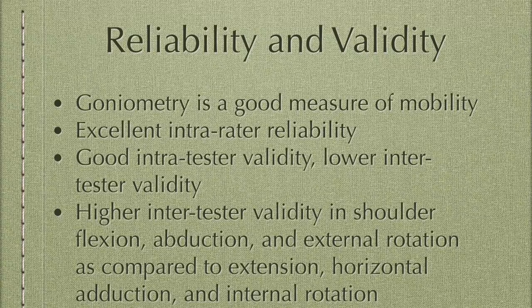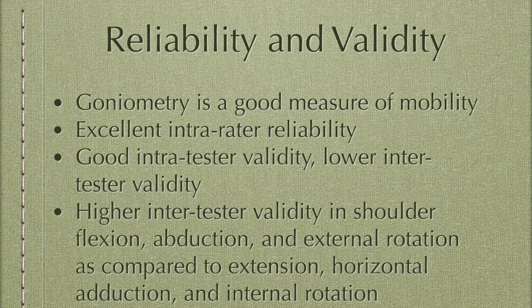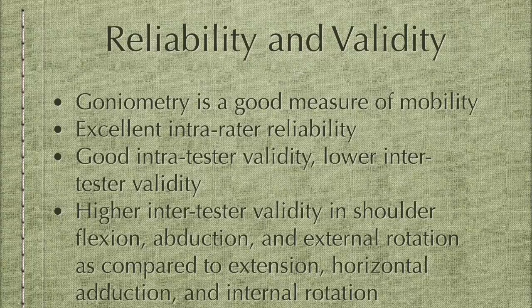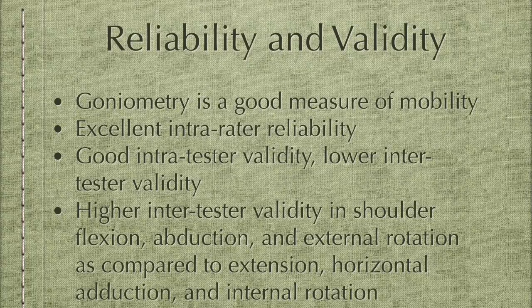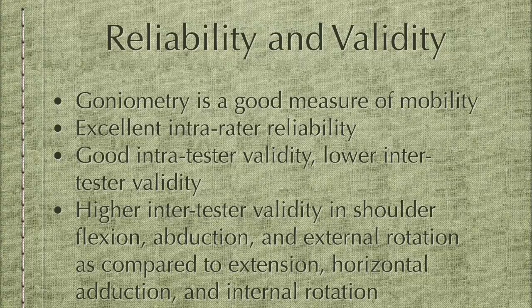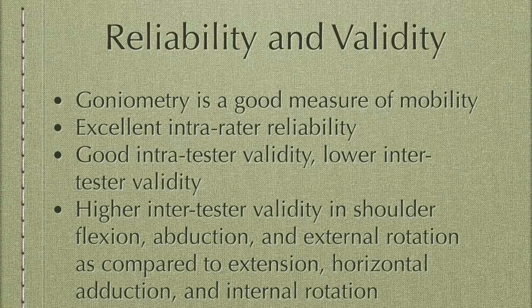However, flexion, abduction, and external rotation have a fairly good inter-tester reliability, especially compared to measurements of extension, horizontal adduction, and internal rotation. This is because it is more difficult to standardize the position and goniometer placement for extension, horizontal adduction, and internal rotation.